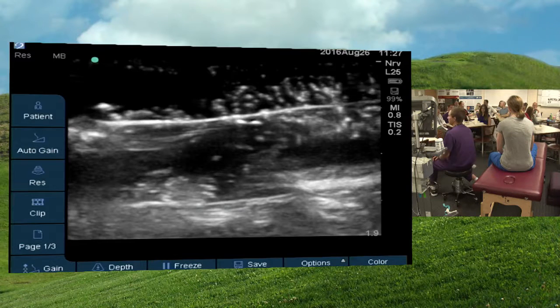Yeah, I can't see that it would. It just seems wrong. Yeah, it'd probably still flow just fine, and the pressures would be the same. With really valvy vessels, if you go in the direction of turning them around, it probably would help. Yeah, could be. It'd be something to try if you're out of options. So you could try to flip it 180 degrees.